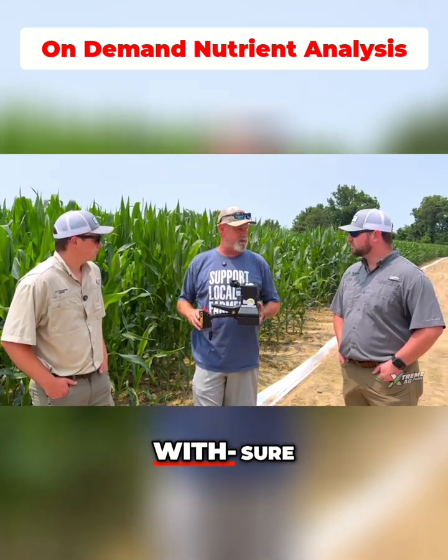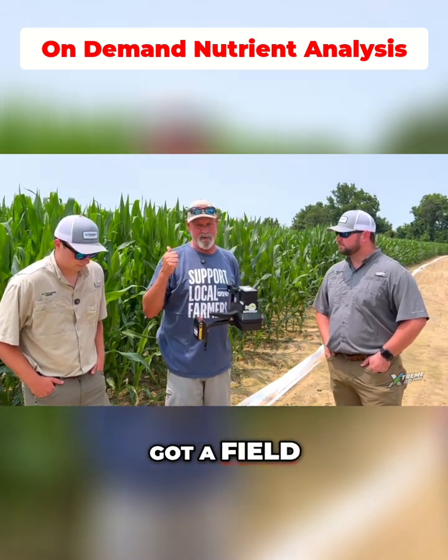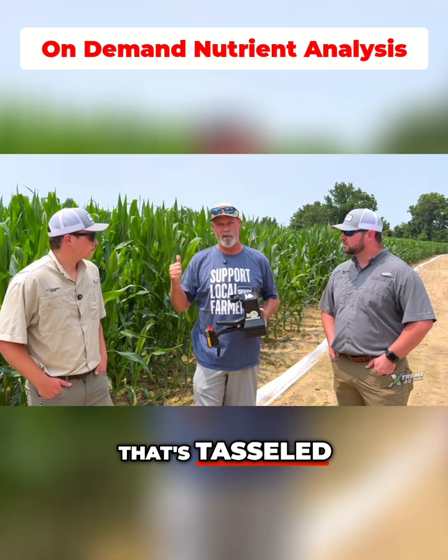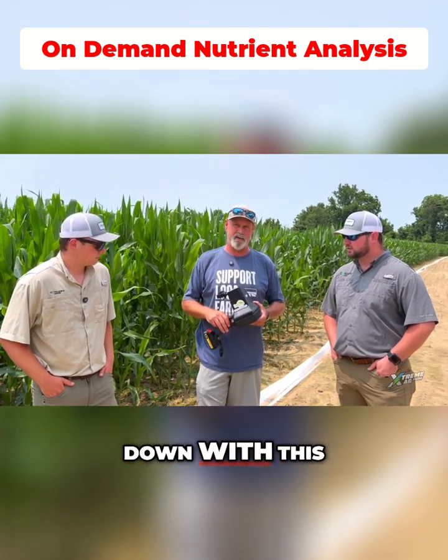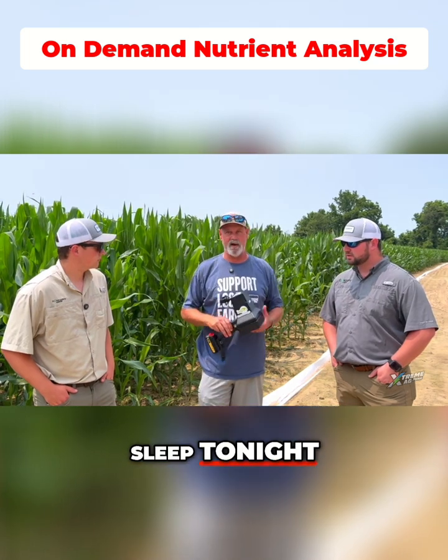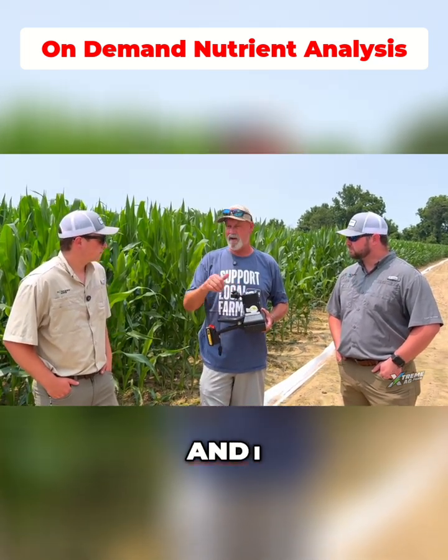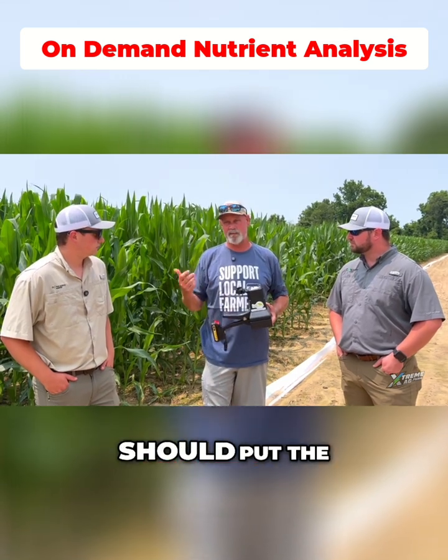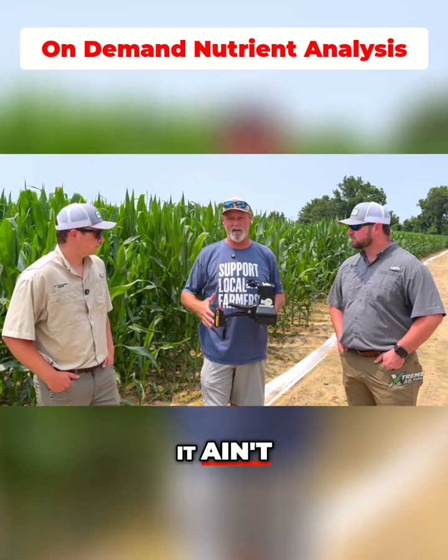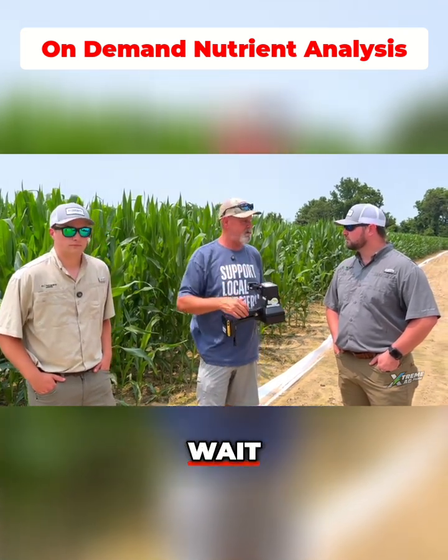So this is something you run out in the field with, take samples and know where you're at. We've got a field that still has probably about 80 units of nitrogen on that's tasseled. I asked Reed and Garrett to come down with this and let's go through this field and look at it — that way I can either sleep tonight or not. This tool gives you on-demand answers, so I don't have to wait three or four days to know whether I should put the airplane in there with the ground a little more moist or wait, or if I'm tasseling, do I have time to wait?